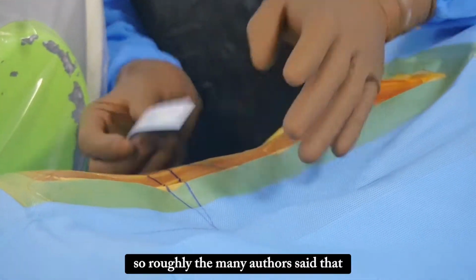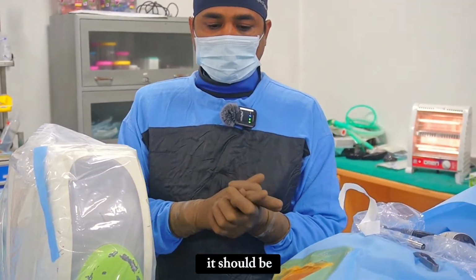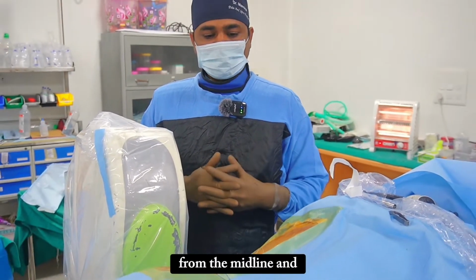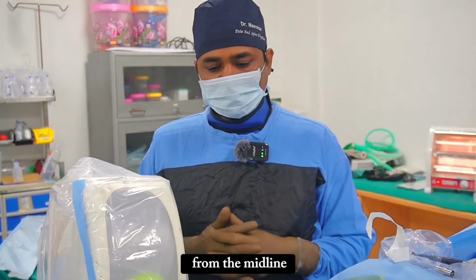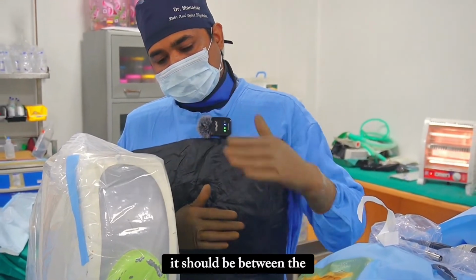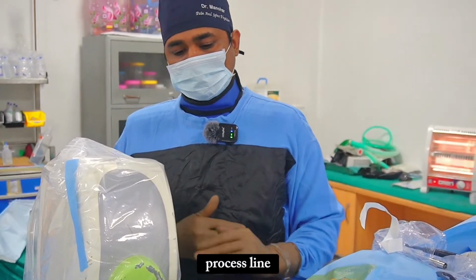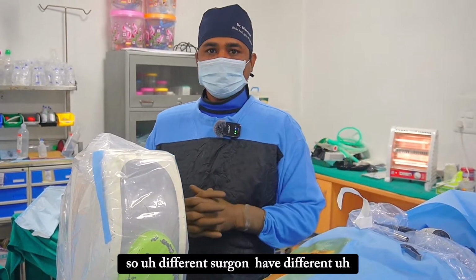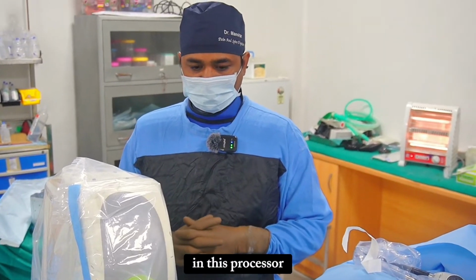If we measure from the center or the midline, this is about 14 centimeters. Roughly, many authors said that it should be 8 to 12 centimeters from the midline, or 9 to 11 centimeters from the midline, and some authors said that it should be between the spinous process line and the facet line. So different surgeons have different methods to mark the entry of the needle in this procedure.